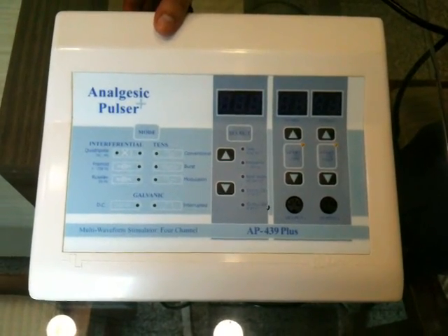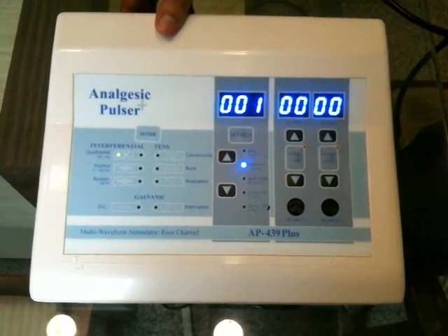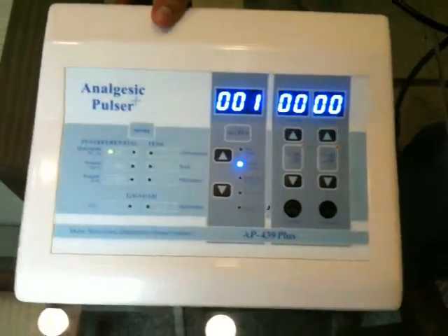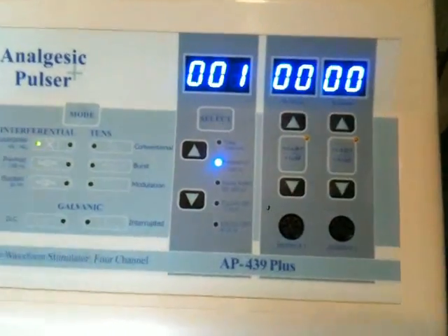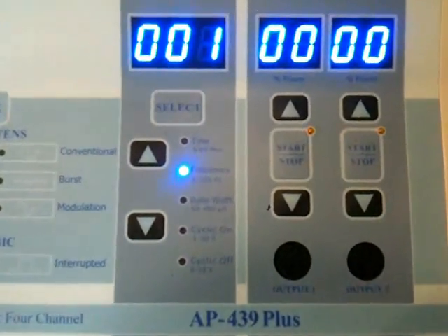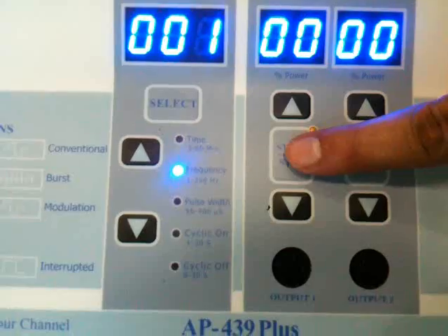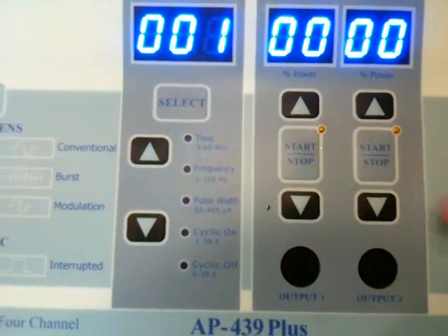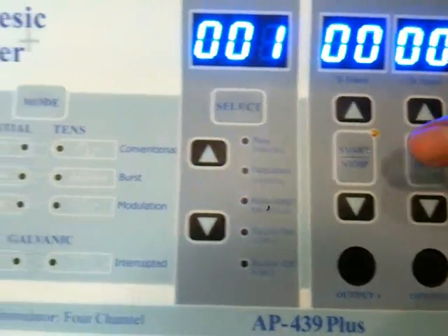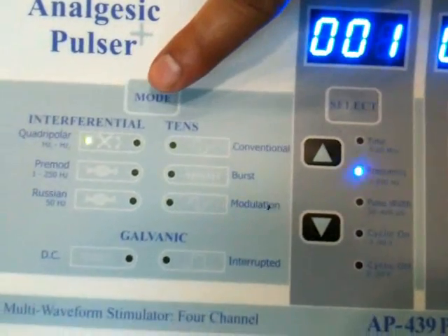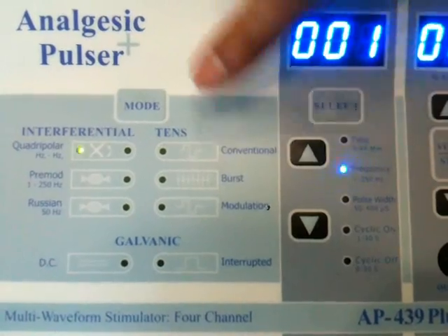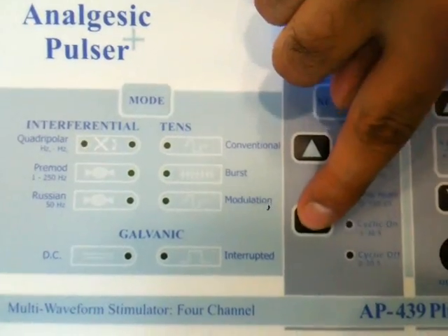Now turn on the unit. Here is output 1 and output 2. Selecting output 1. The LED lights are blinking, indicating the modes.